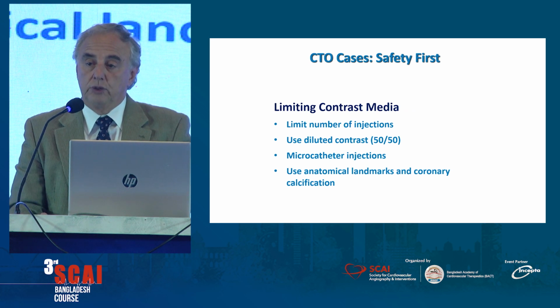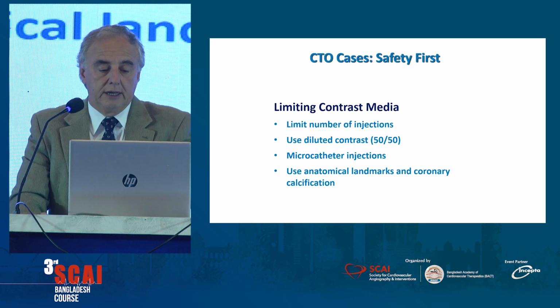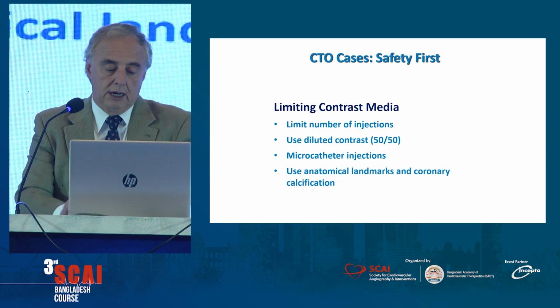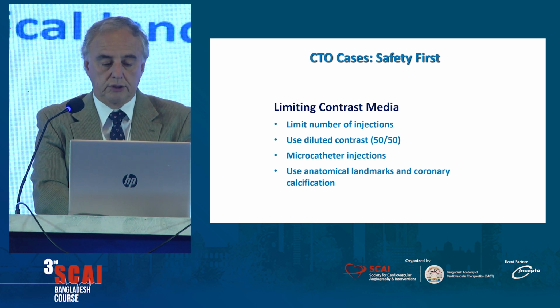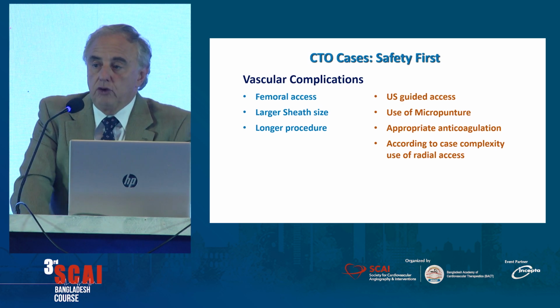So the other one is, as we saw in the previous talk, you can do it with limited contrast, so limit the number of injections, use diluted contrast, microcatheter injection, and use anatomical landmarks and coronary calcification to guide your procedure.